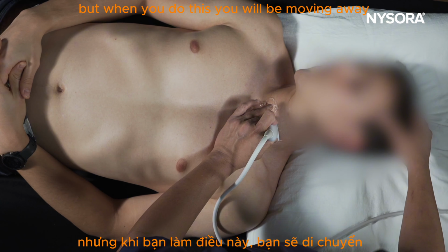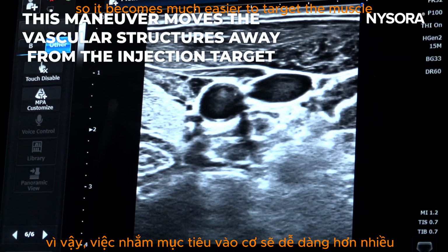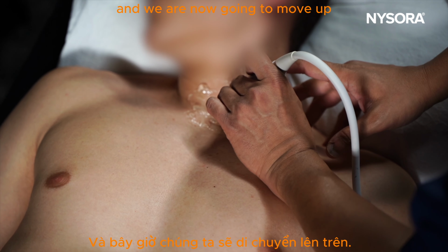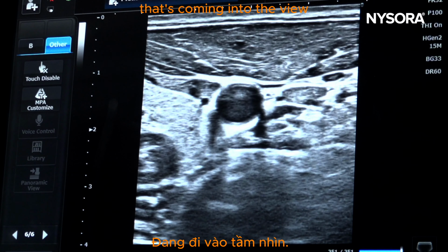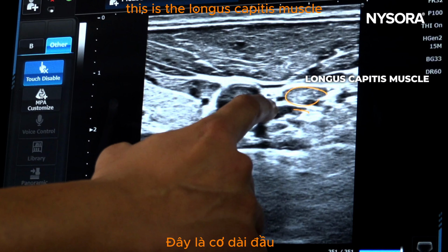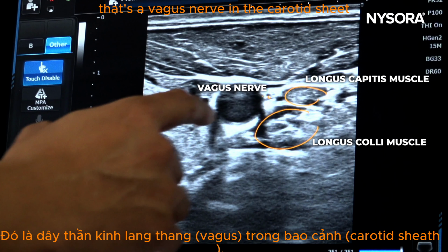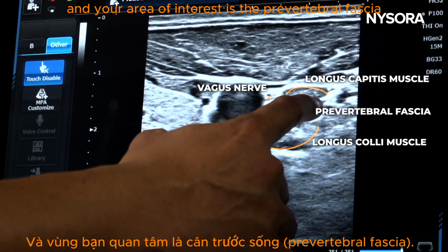But when you do this, you'll be moving the vascular structures away from your target. So it becomes much easier to target the muscle. Now in this view, you can nicely see the longus colli muscle, and we are now going to move up, and you will start to see another muscle coming into the view, and I'll show you this here. This is the longus capitis muscle. That's the longus colli muscle. The small dot you can see, that's a hypoechoic area. That's the vagus nerve in the carotid sheath, and your area of interest is the prevertebral fascia.